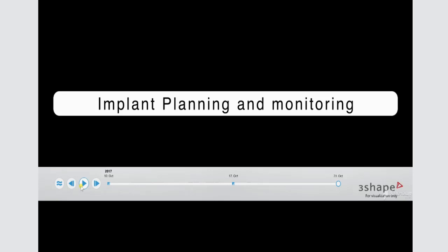In this first implant case that I will be sharing with you, the inspiration that I hope to give to the people watching my presentation is that you plan the implant and you monitor what you're doing. So you're going to see that I start by scanning my patient, and then I plan the implant, and then place the implant, and then scan the patient, and then produce the restoration, and then scan the patient again until you finish. And then what you're creating is a timeline. That's the word that we all must have in mind. It's timeline. I timeline my patients.